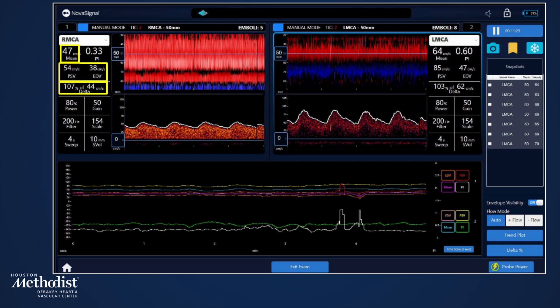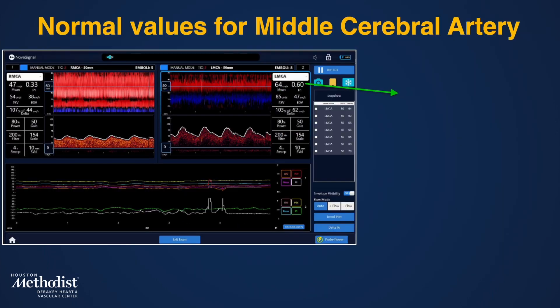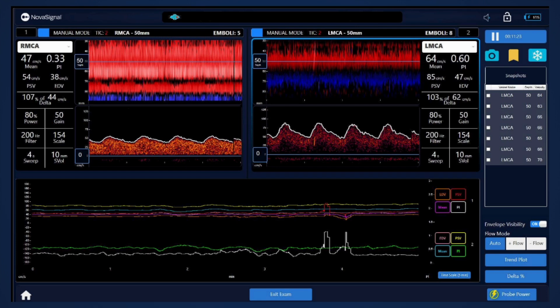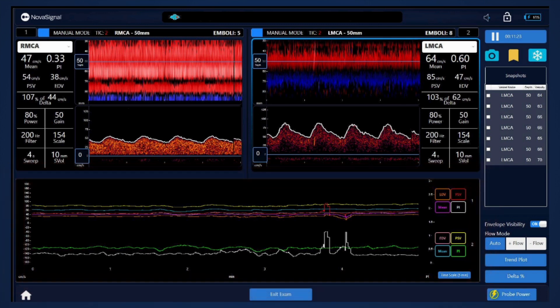Delta is the current mean flow velocity compared to the baseline, expressed as a percentage — and the baseline can be reset any time during monitoring. Pulsatility index (PI) reflects the difference between flow velocities during systole and diastole. Normal PI values in the MCA are between 0.6 and 1.1, and normal mean flow velocity values are 50 ± 12 cm/s. Trend plots on the TCD screen track these monitored values over time, displayed graphically at the bottom of the screen. We recommend tracking mean flow velocity and PI values during procedures.